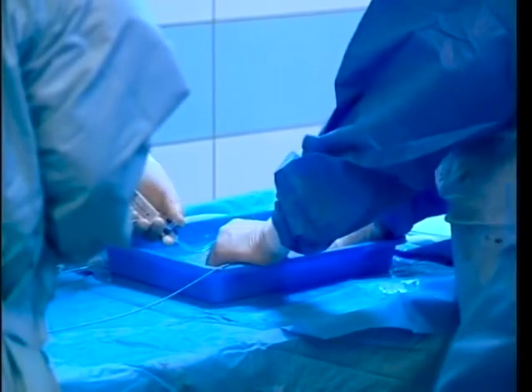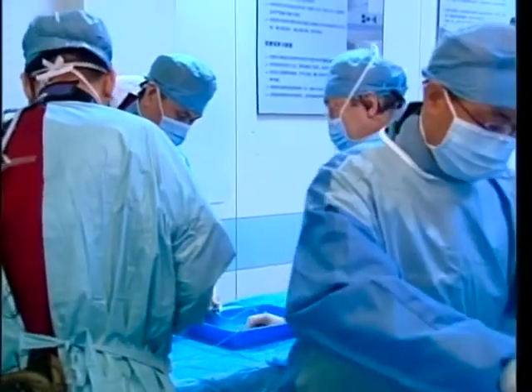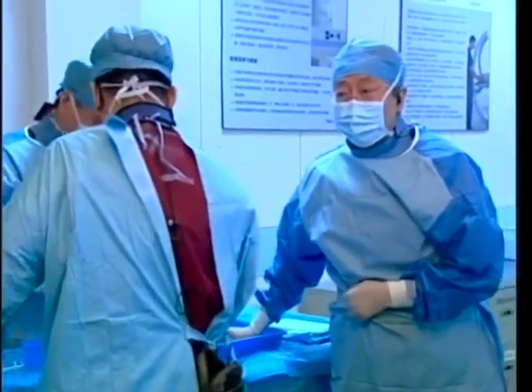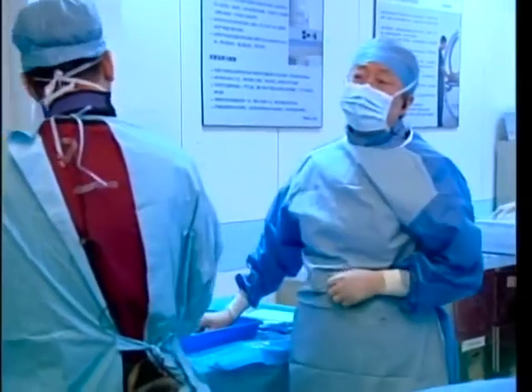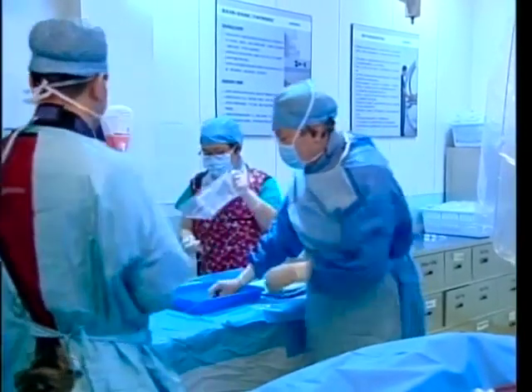So we have an overview. All cases done in human until now is within studies. So therefore, we have a 100% follow-up, missing no patient. And this is meanwhile more than 260 cases and no single embolization reported so far.